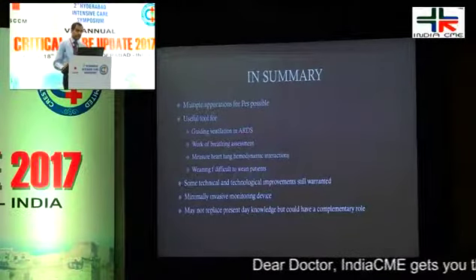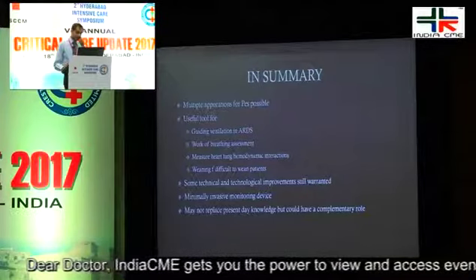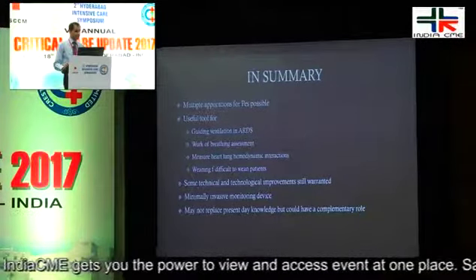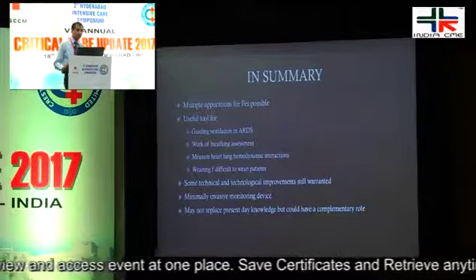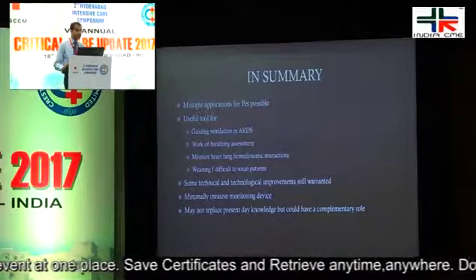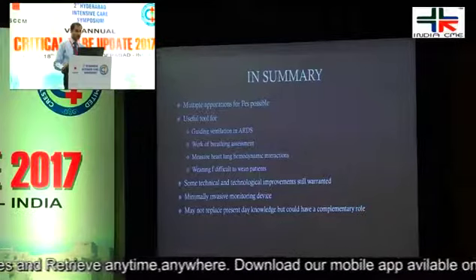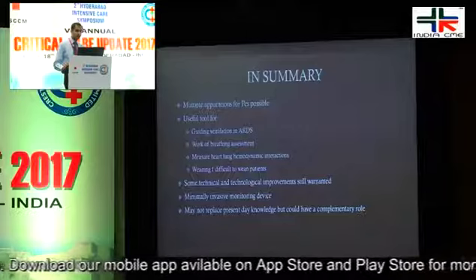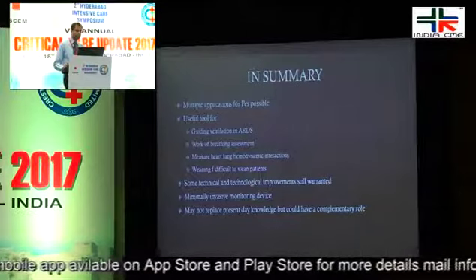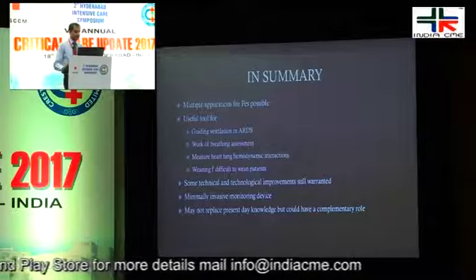So in summary, multiple applications for the esophageal pressure monitoring system are possible. At the moment, it is still a research tool, and probably needs more clinical research before we put it into practice on a regular basis. It does help in guiding ventilation in difficult patients of ARDS, assessing the work of breathing, measuring heart-lung hemodynamic interactions, appropriately organizing your cardiac output monitoring and assessment, and weaning of difficult patients as well.